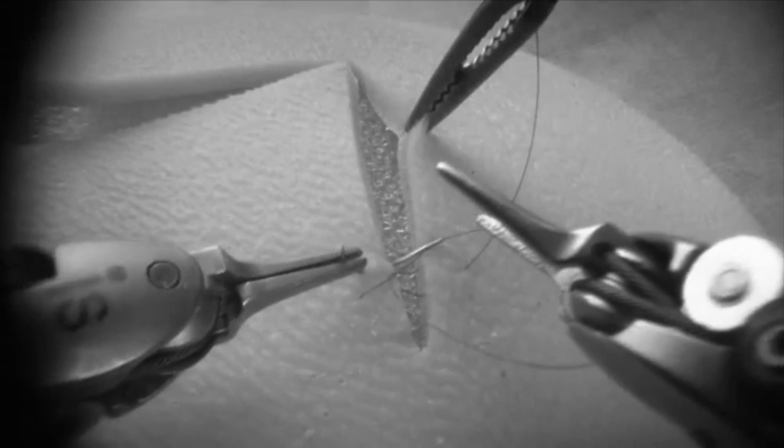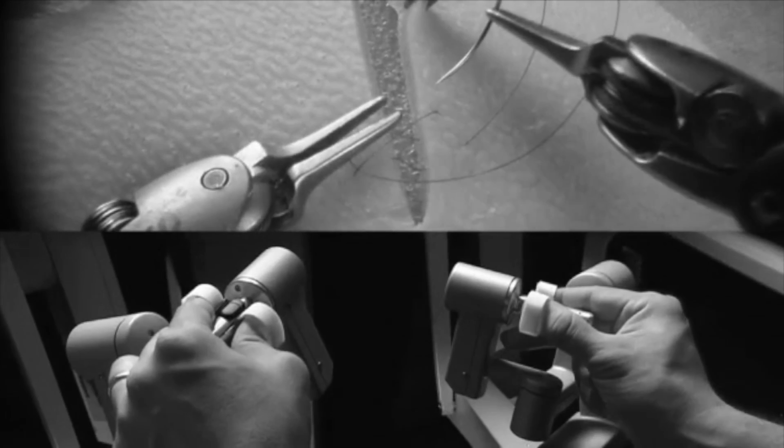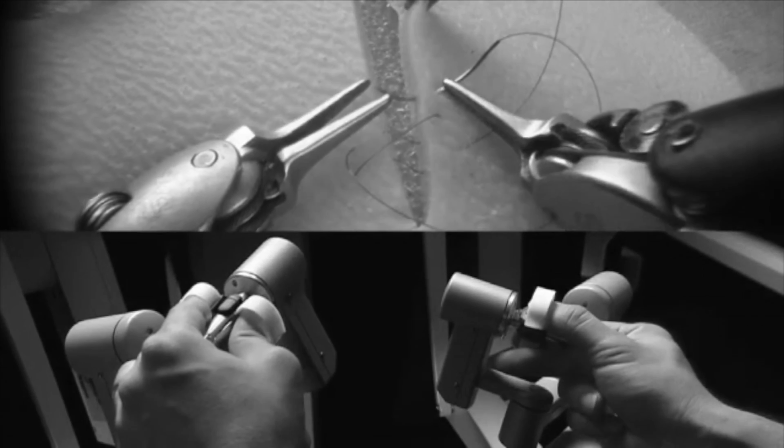Then you fly to a laboratory where you operate on tissue, and we went to Belgium, and you have a 2-day training on positioning the robot, putting it safely on, taking it off again, and make sure that you know every step before you start on a patient.